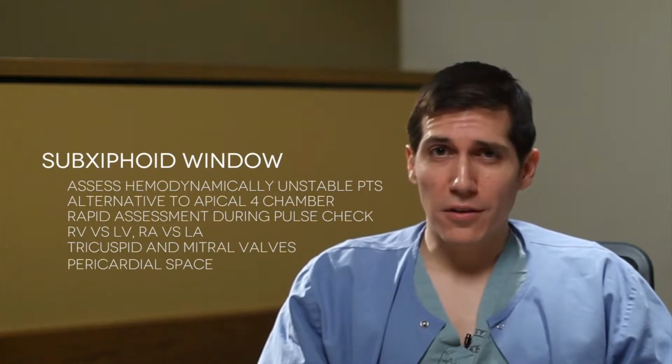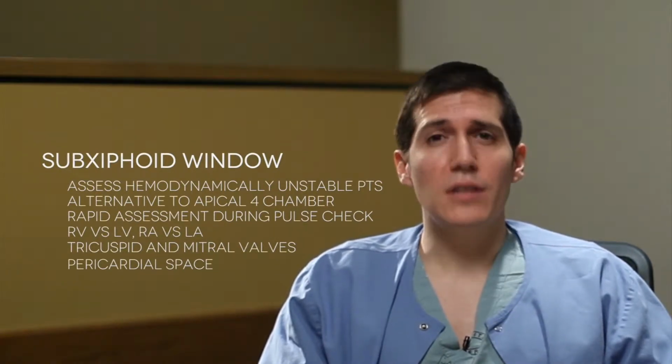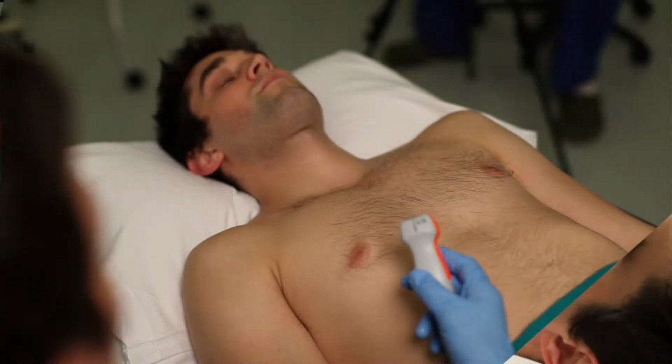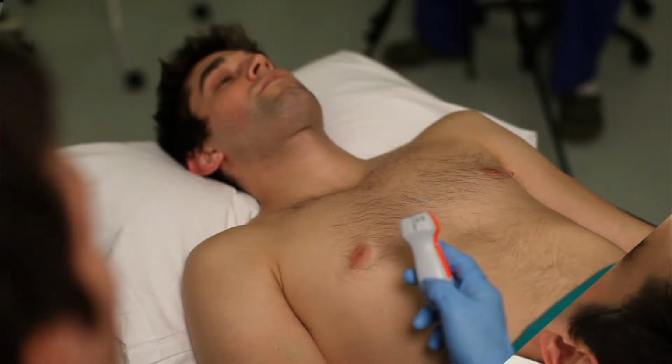So the final thing is to acquire these images. So let's get to it. We're going to be performing the subxyphoid window views. Of course, we have our phased array probe here.